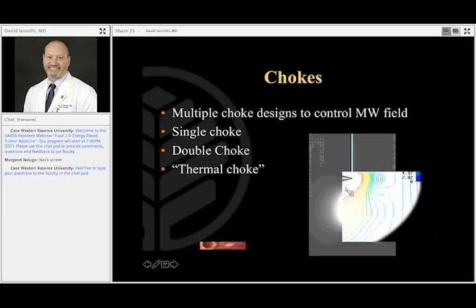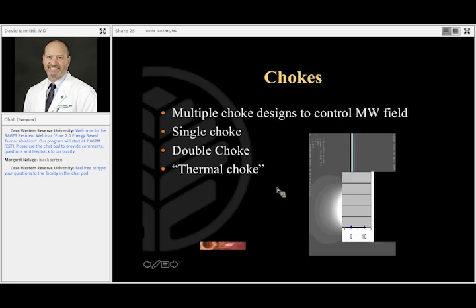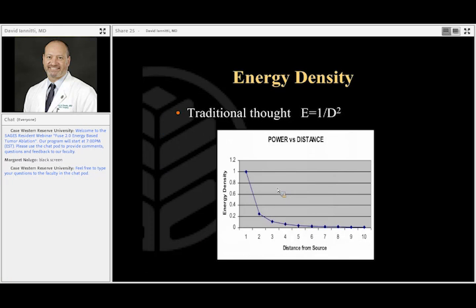And you can see here's how the wave comes off an antenna. Remember, the tip is really the antenna. So now you're saying to yourself, okay, Dave, this doesn't really make a lot of sense. We're passing electromagnetic waves through tissue. I remember from physics in high school that the energy of a wave falls off at 1 over distance squared, right? Anyone remember that? So that means that the further you get away from the radiating tip, the energy is going to fall off really dramatically, theoretically.